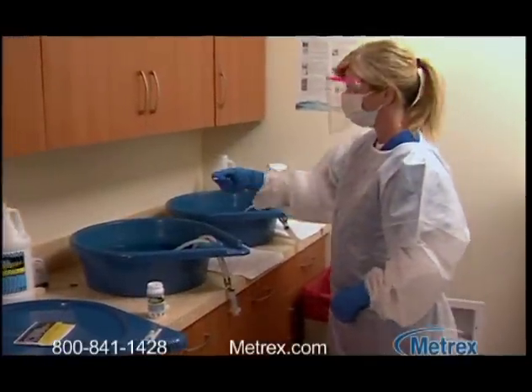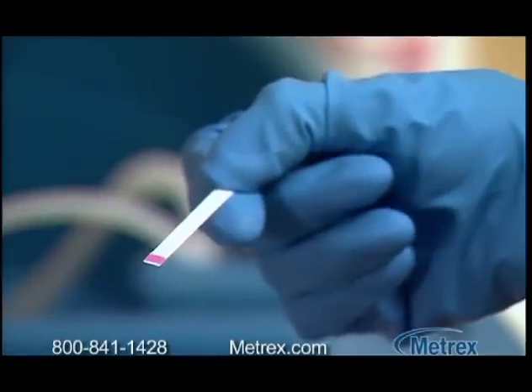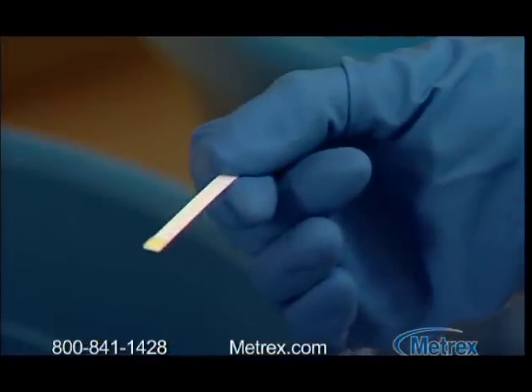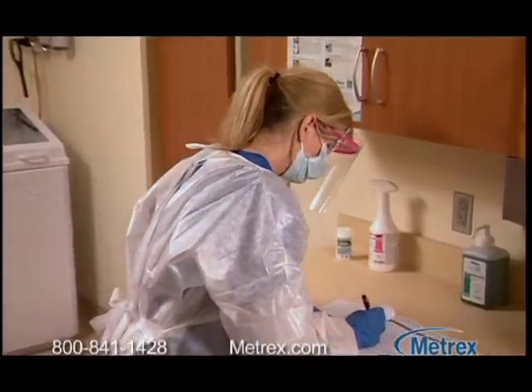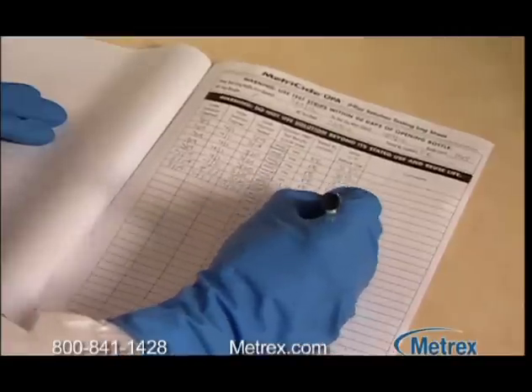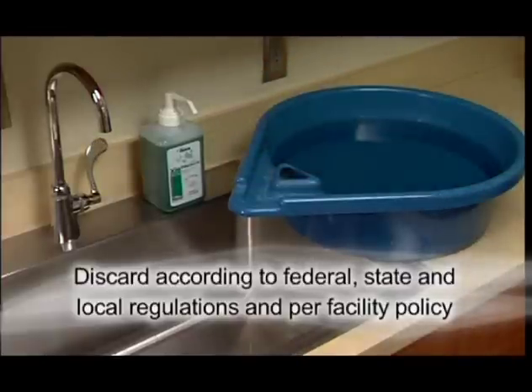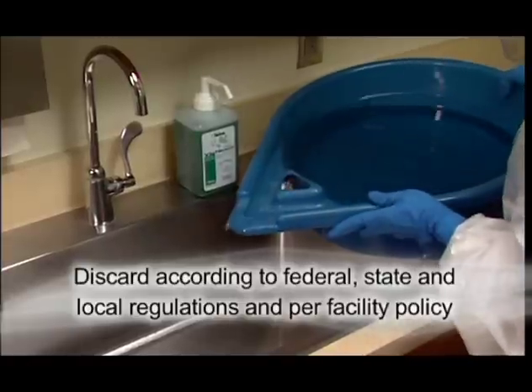Hold the strip horizontally. If the strip is completely magenta, the OPA is at or above the 0.3% MRC necessary for high-level disinfection. If any yellow appears, the solution should be discarded. Be sure to log the test results in the log book. After 14 days, all used solution must be discarded, even if the test strip indicates a concentration above the MRC. Be sure to discard the used solution in accordance with federal, state, and local regulations, and per facility policy.